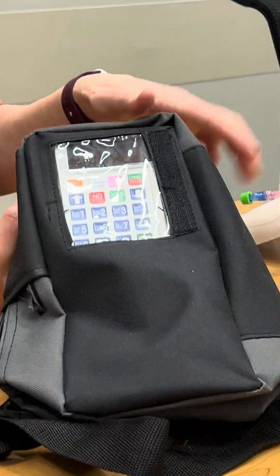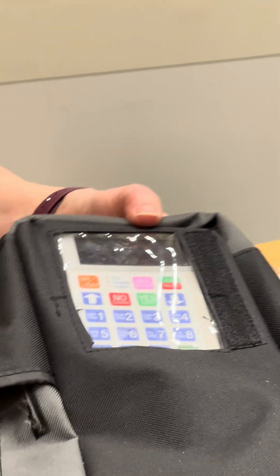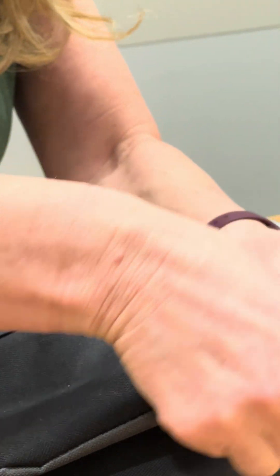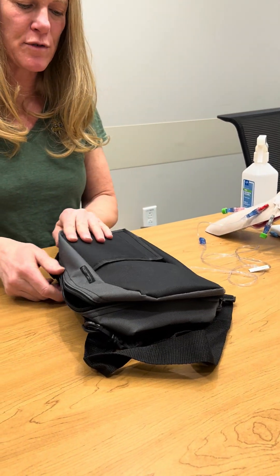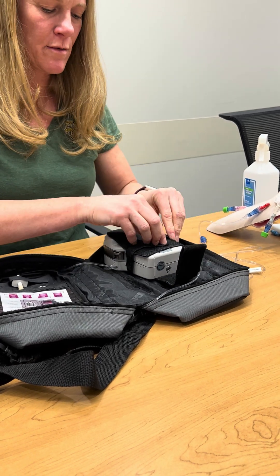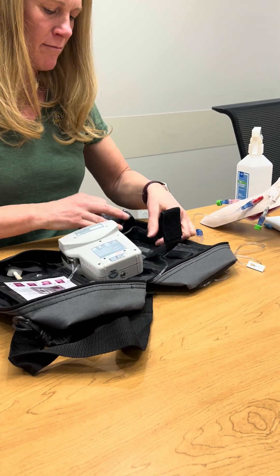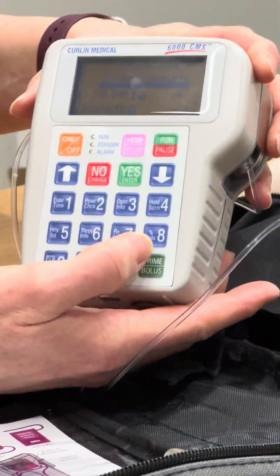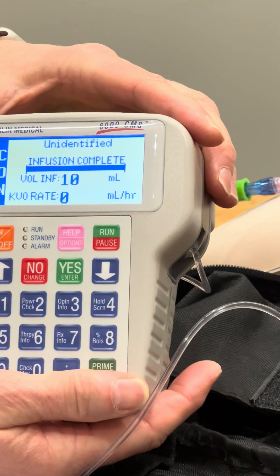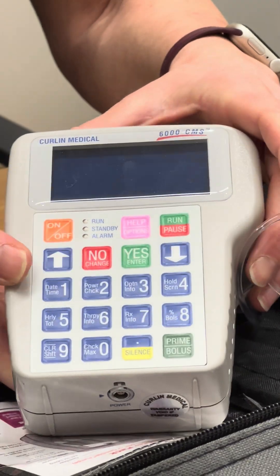In this bag we have the pump — you can see it through this window. That green light is flashing; it's still running. I'm going to get prepared and open the pouch. That beep is telling me my infusion is complete. I'll push a button to see the screen — this infusion is complete. I'm going to turn the pump off: to turn it off is pause and then off. I'm going to set this aside for a minute.